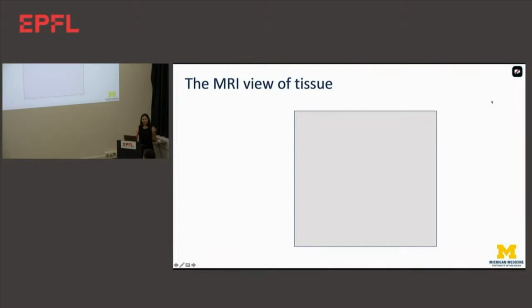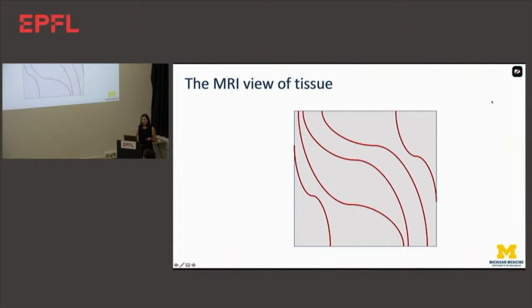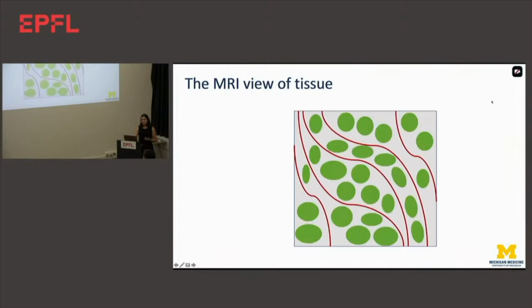Instead, we have blood vessels, we have cells. These are each going to have their own T1 and T2 values, which are going to conglomerate together. We might have exchange between these different compartments. We may have pathological tissue. There's all sorts of things going on that I'd prefer not to think about when I'm making my quantitative measurement because it just becomes way too complicated.